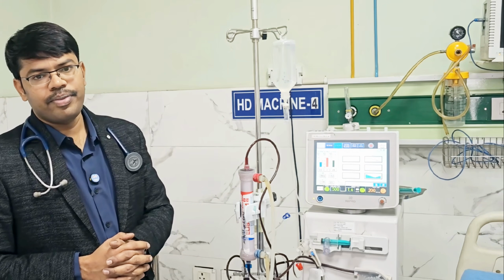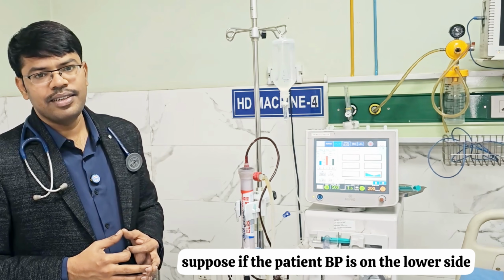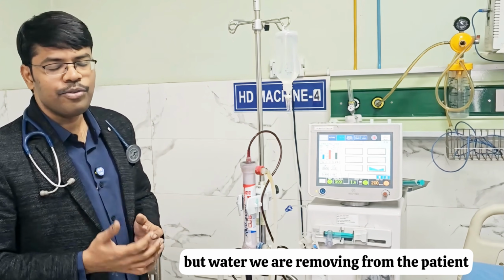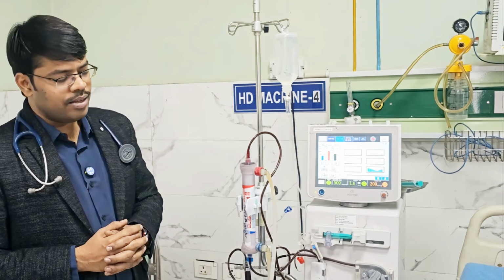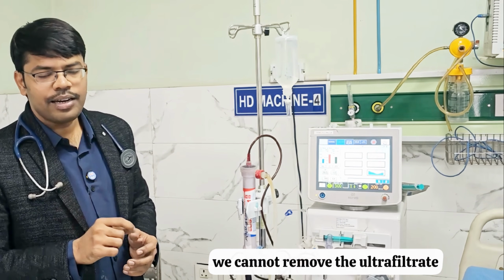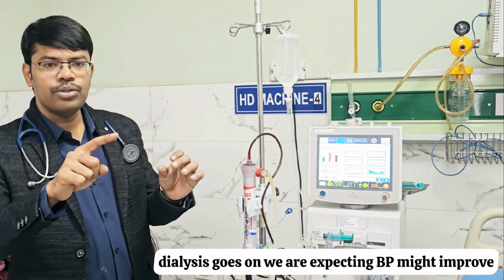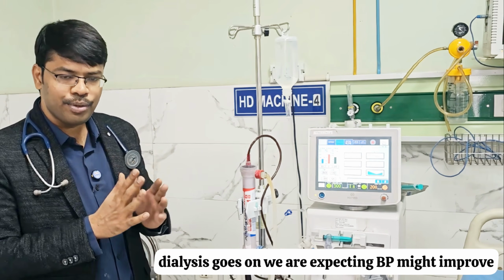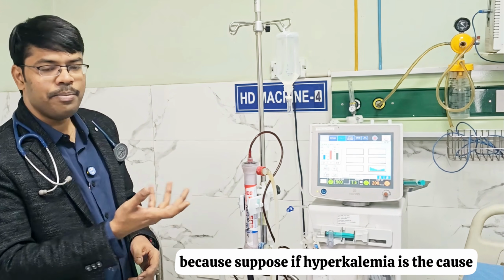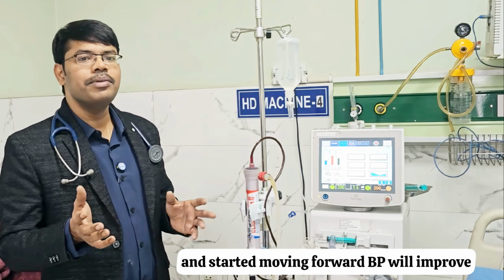When we do, suppose if the patient BP is on the lower side, we want to remove ultrafiltrate. Ultrafiltrate is nothing but water we are removing from the patient. BP is already low, let us take it as 100. During that time we can't remove the ultrafiltrate. We want very minimal ultrafiltrate. As the dialysis goes on, we are expecting BP might improve. Don't ask the question why the BP will improve, because suppose if hyperkalemia is the cause, as the dialysis started moving forward, BP will improve.